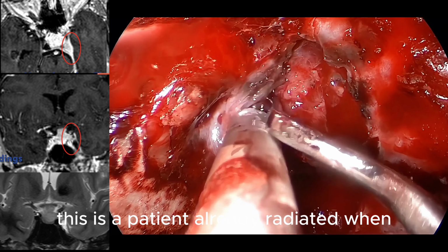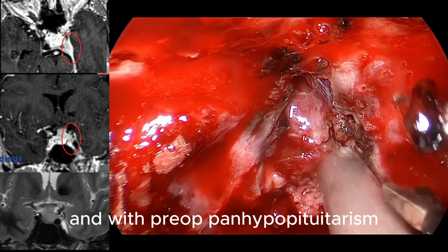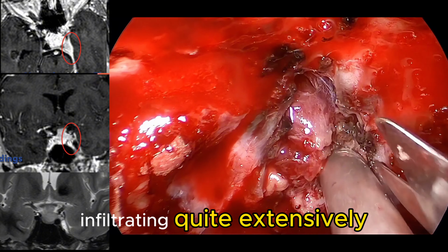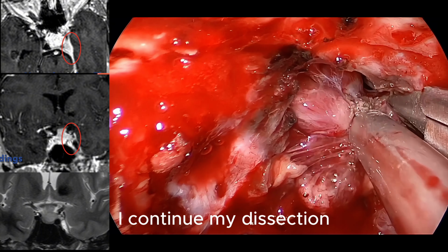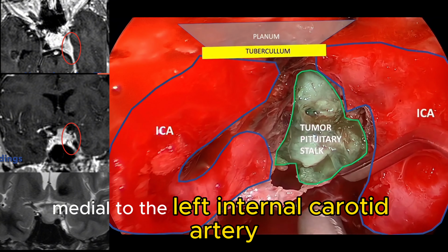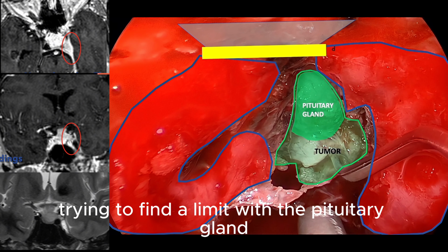This is a patient already radiated and with hypopituitarism. So we see that the tumor is actually infiltrating quite extensively the pituitary gland, and it's difficult to find a margin. I continue my dissection medial to the left internal carotid artery, and I go again trying to find a limit with the pituitary gland.